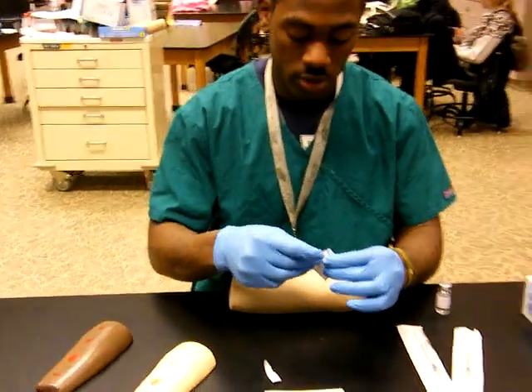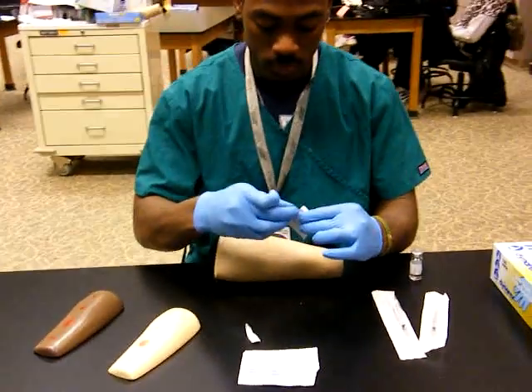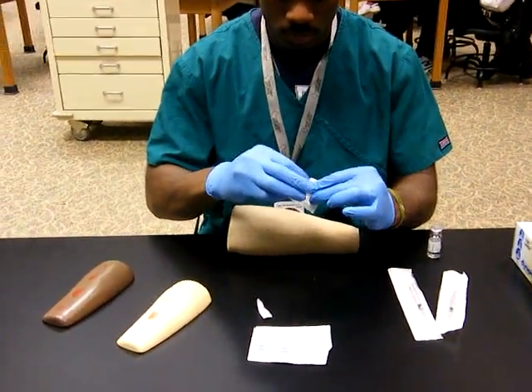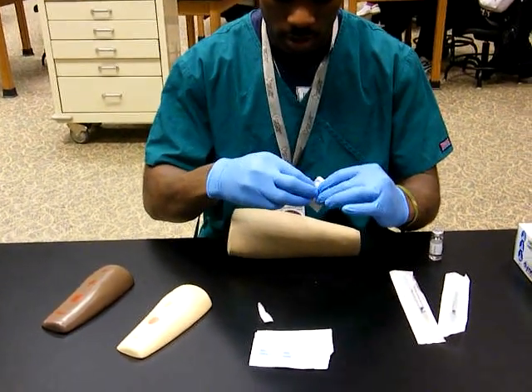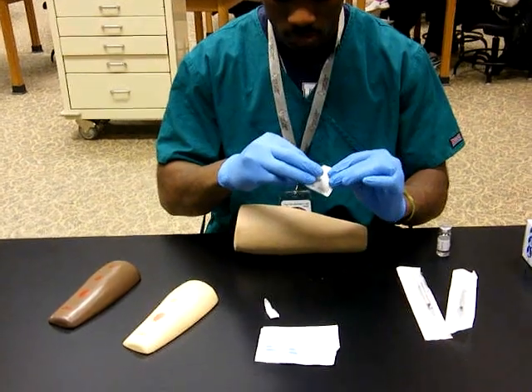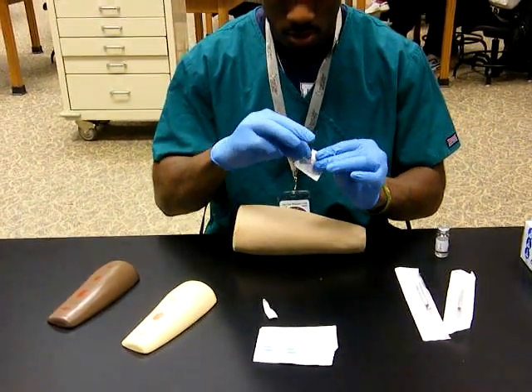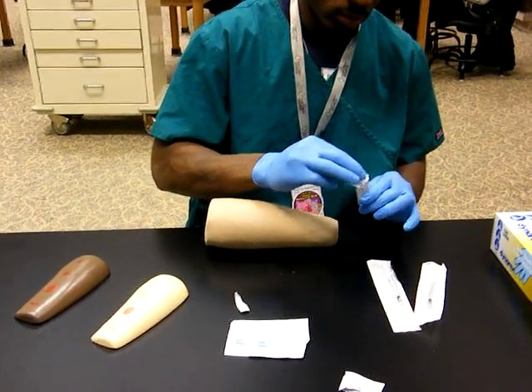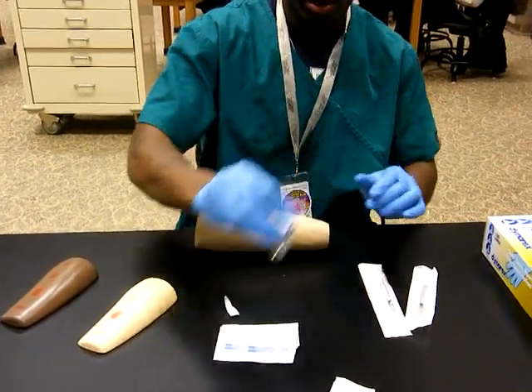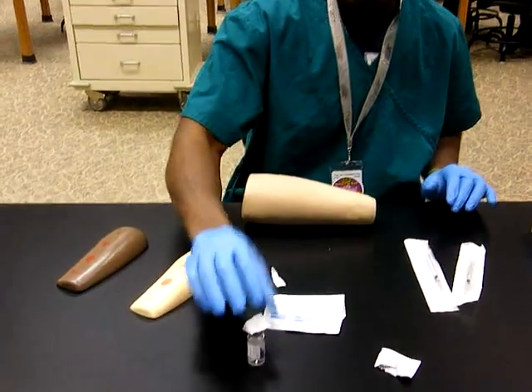Then you wipe it off with a sterile pad, and you leave it on there. Set it down.